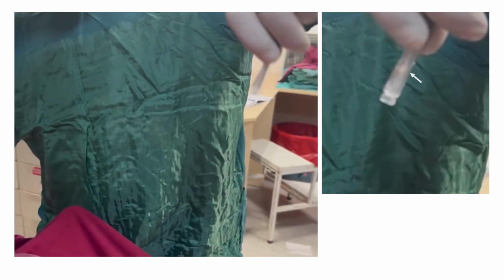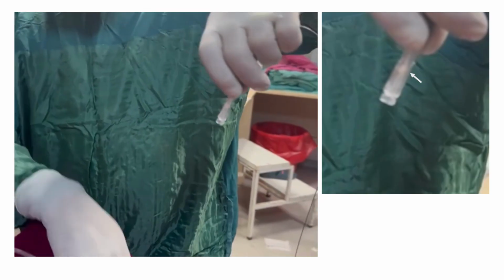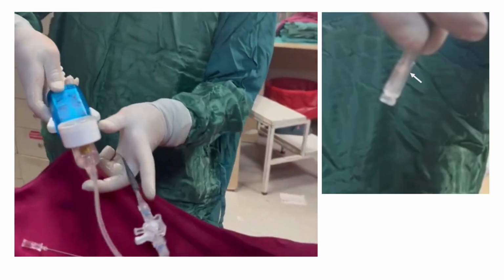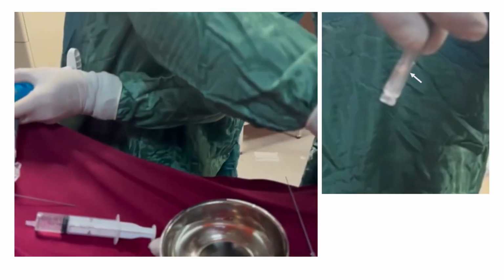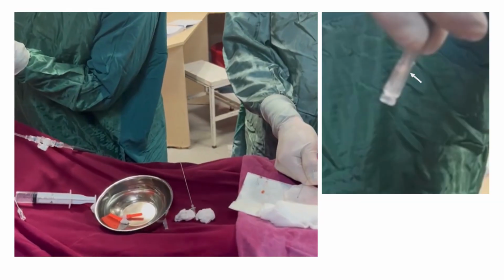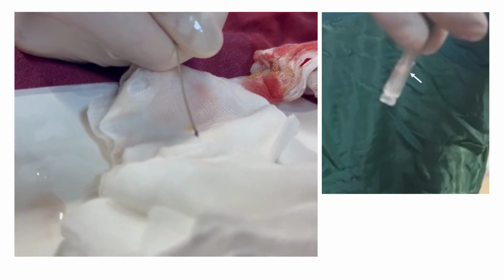A very small section of the removed tissue was placed into the proximal microcatheter port, then the port was inverted. The fat, lighter than water, was expected to migrate into the microcatheter lumen. However, because the fat adhered to the port edges, these maneuvers were facilitated by using the reverse of the floppy wire.